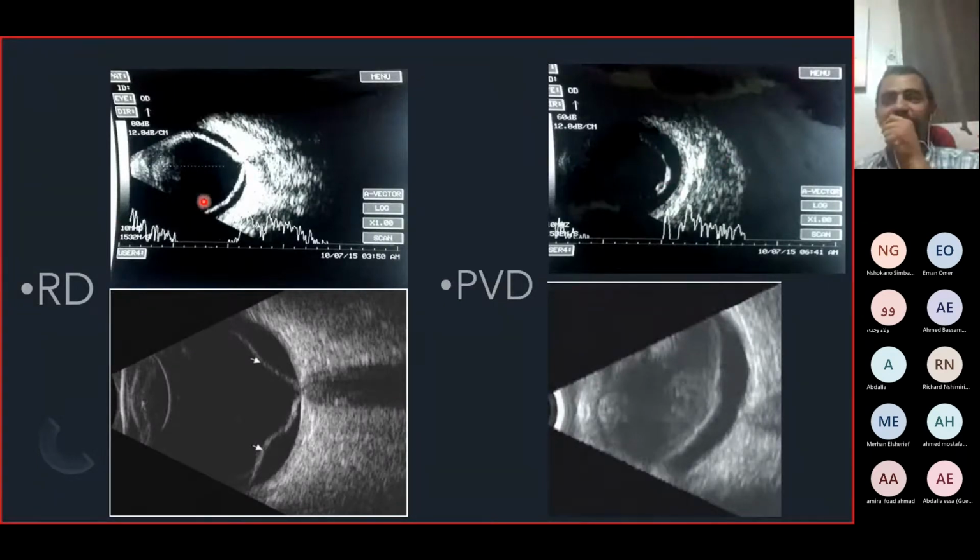While the retina, especially if it's a neglected retinal detachment, will become fibrosed and very stiff, and it will not show mobility on kinetic examination. So those are the differences: attachment to the optic nerve head, A vector reflectivity, whether it is high and close to the sclera or less than the sclera, persistence on lowering the gain, and kinetic mobility. Okay?